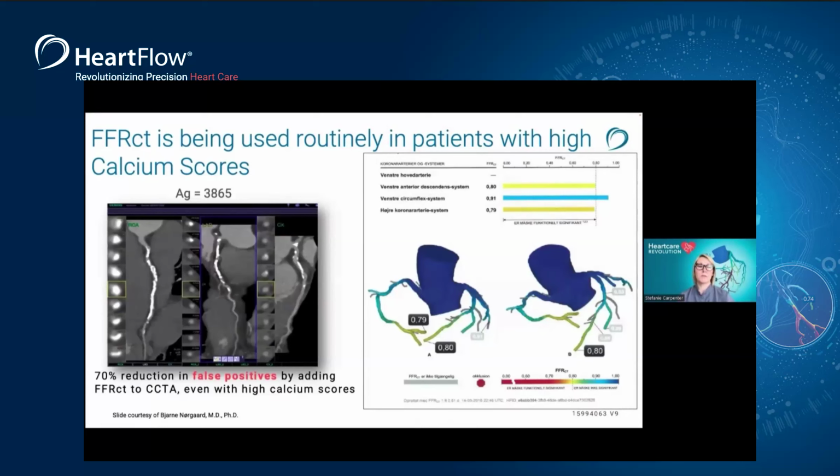Additionally, if you look closely in the MPR sections, you will notice that despite a high calcium burden, the lumen was able to be identified. Lumen boundary clarity is crucial, which allowed this study to be processed.